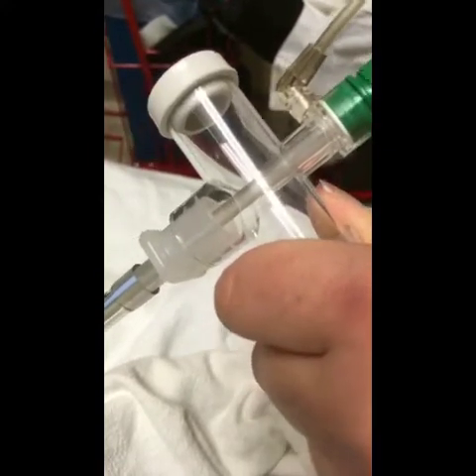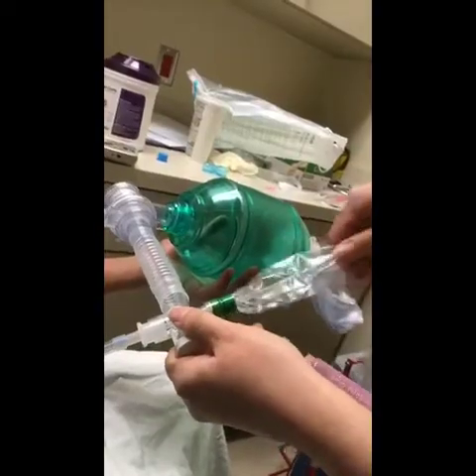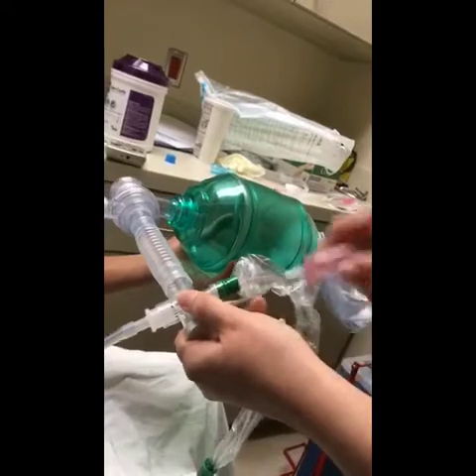Give me a bag. Mucus plugging is a very common cause of high pressure alarms on ventilated patients, especially after they've been moved for a bath or to be turned. Many times you can advance the suction catheter, apply pressure, and get the mucus plug dislodged. If you're unable to advance a catheter, you could try bagging the patient and instilling saline to dislodge the mucus plug.